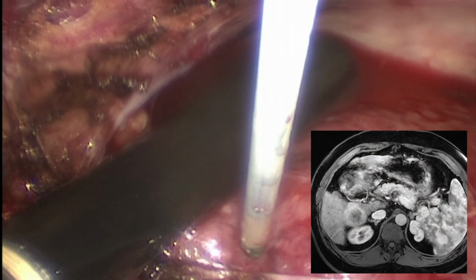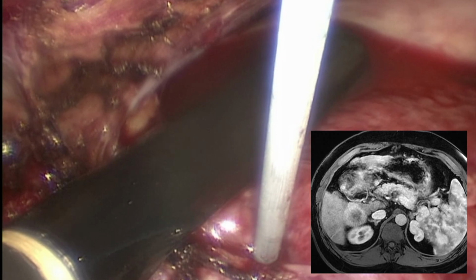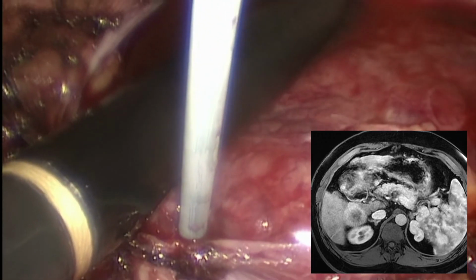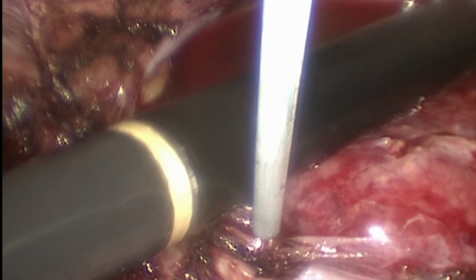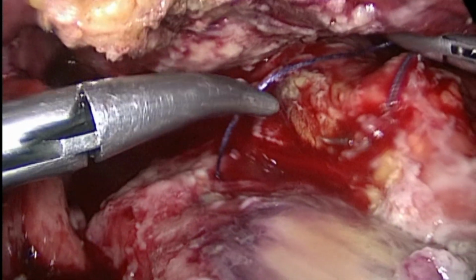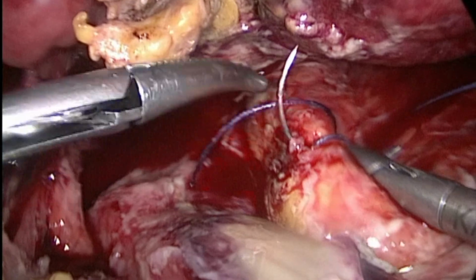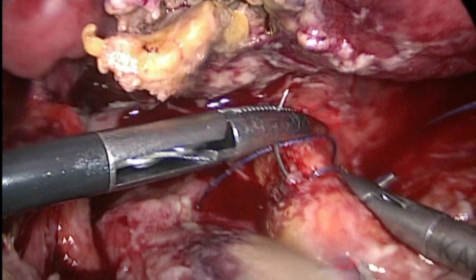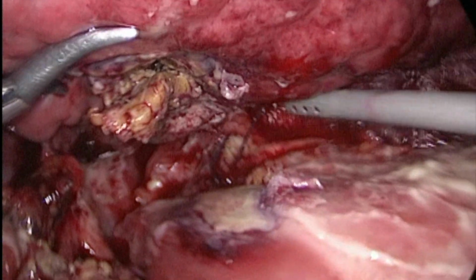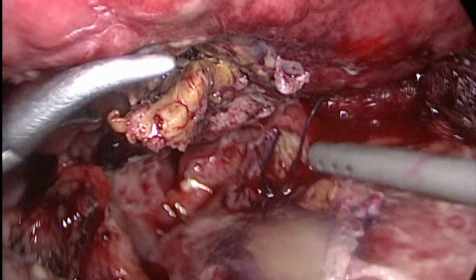In another case, a lesion located on the surface of the sixth segment was treated by microwave ablation. Adhesions due to previous operations between the liver and the abdominal wall and viscera were taken down using an ultrasonic coagulator and bipolar forceps. Unfortunately, the postoperative period was complicated by duodenal perforation, probably due to the adhesion dissections. The duodenal perforation was successfully treated by a laparoscopic suture.